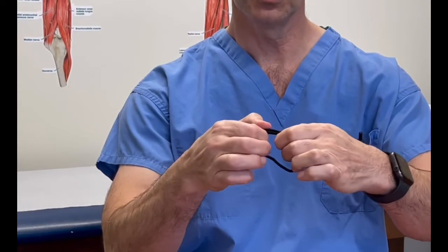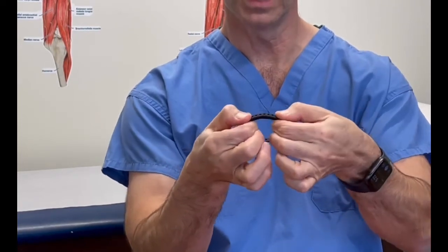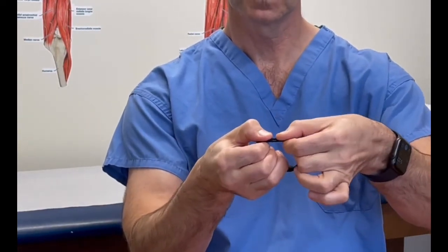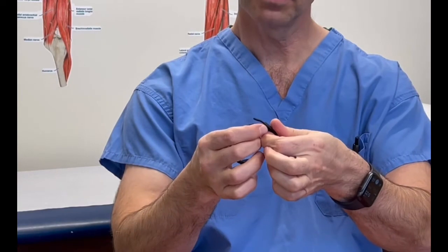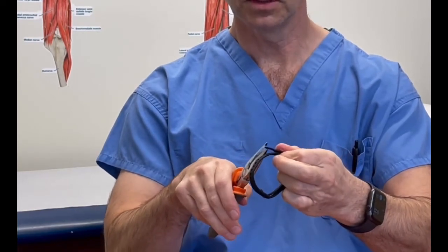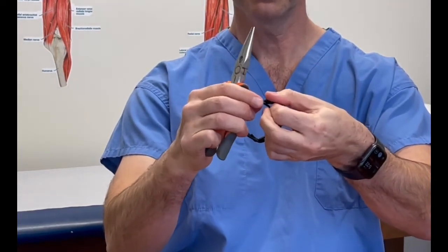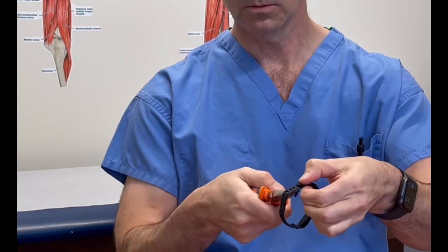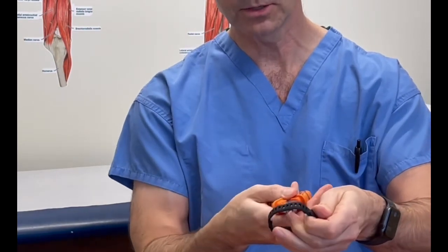Then we're going to move to our other tab. So we hold these together so that we have appropriate length and the splint will lay flat until we get to our other tab. Here we have it. Again, we look at the size. We've got things nice and stable. I'm going to find where the appropriate size is for this, and I'm going to use this hole, and that just drops in, and you see the tab drops in. We bend it back out, and it can either lay flat or go again back up into the adjacent perforation.